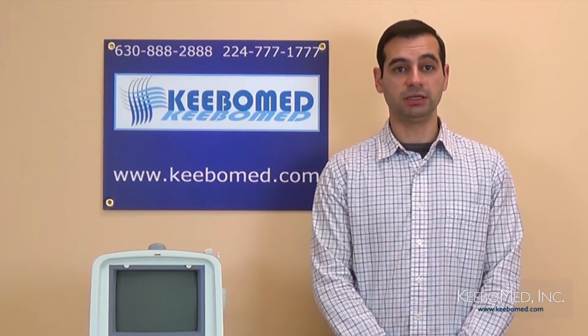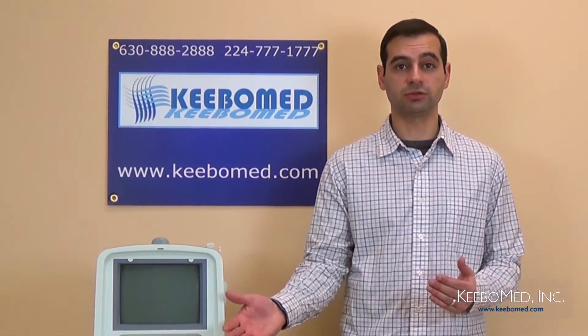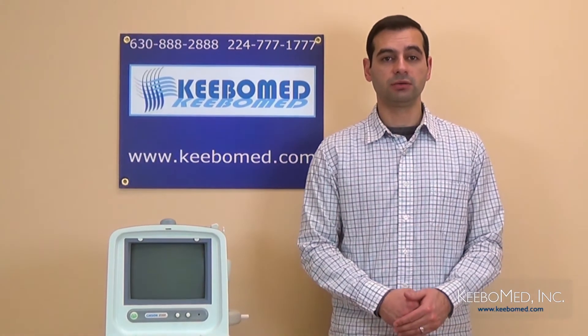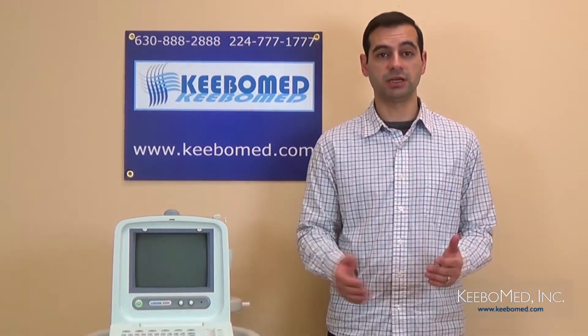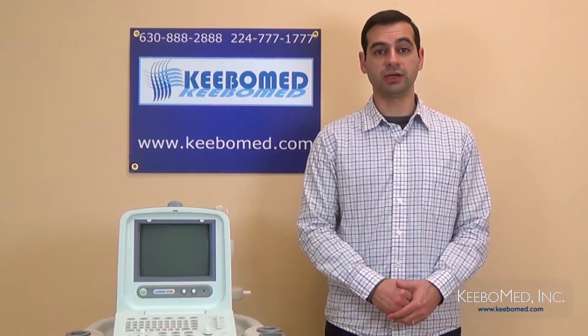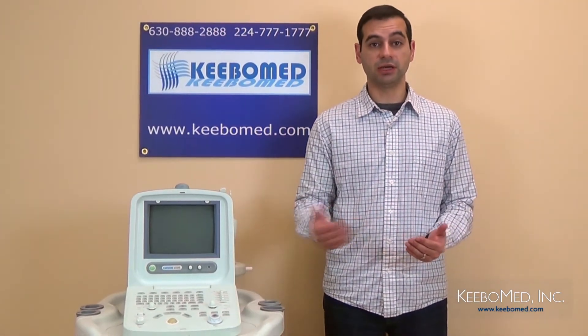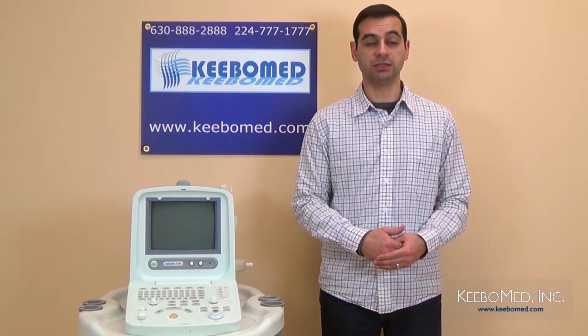Hi, this is Timothy with Kipomed, and in this video we will get a closer look at the Chison 8300 Human Ultrasound. We will examine the keyboard, its layout, the different ports that are found, and also the overall design. So let's first examine the layout and keys that are found on the keyboard.